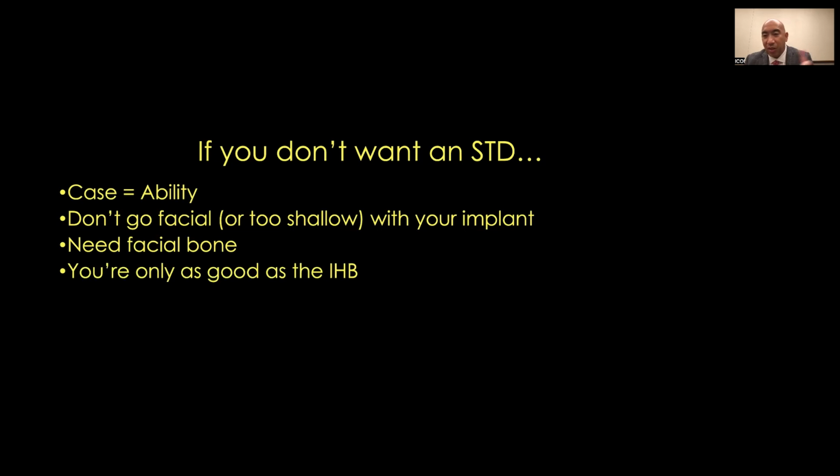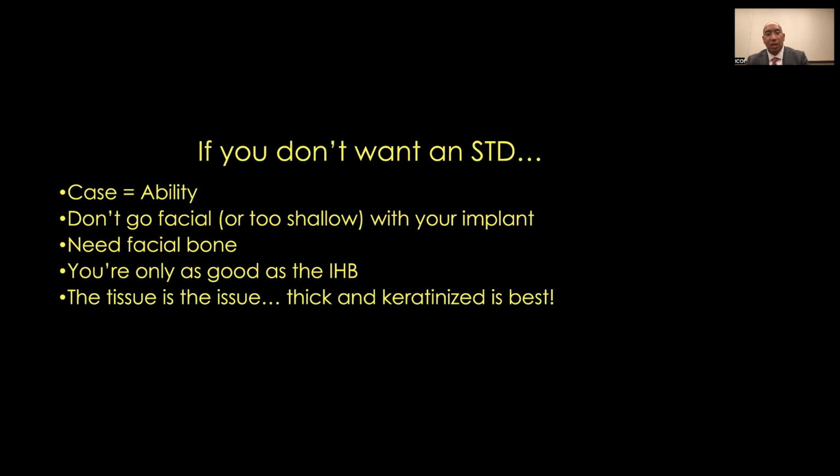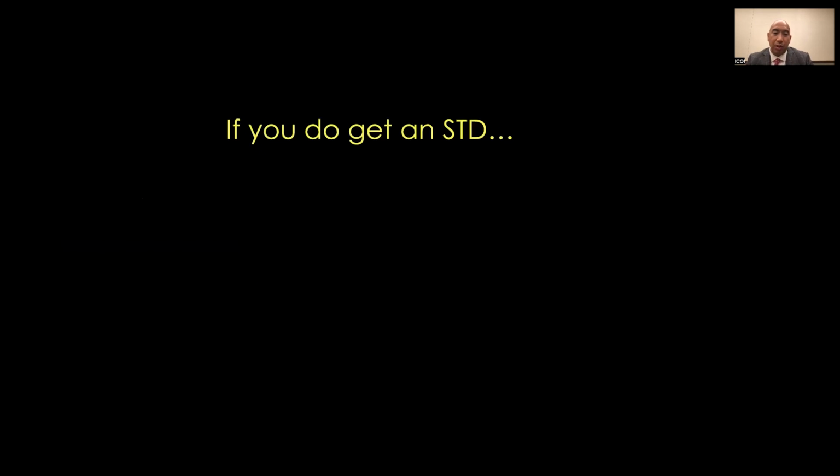So remember how I was talking to the patient about the expectations for papilla heights. If you have interproximal bone loss, don't be promising people nice, full, big, plump papillas, because that's probably not going to happen. So finally, the tissue is the issue. You want thick and keratinized tissue whenever possible.